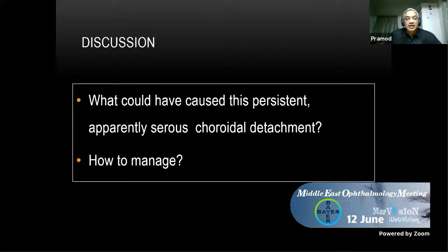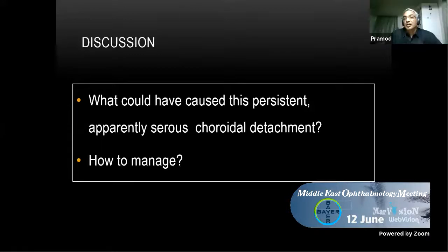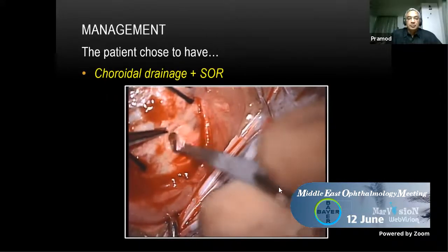Apparently, it's probably a serous choroidal detachment. Some suggestion is that it is due to the presence of silicone oil. Yes, so probably that will come. So what happened? Let me hold on this video.